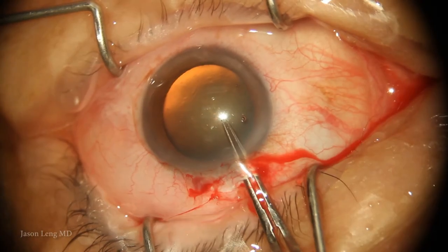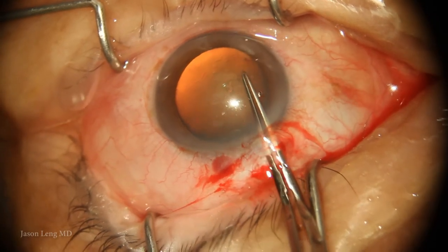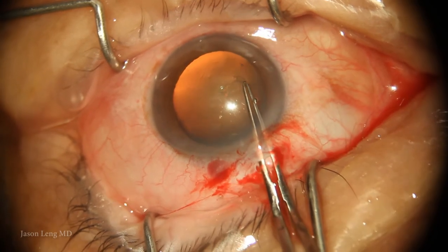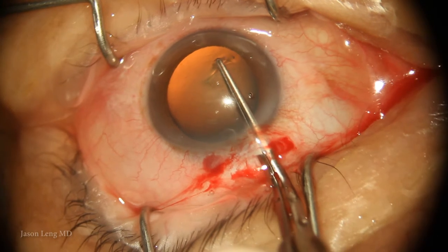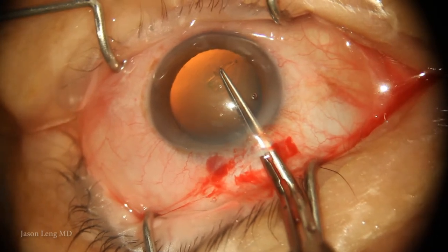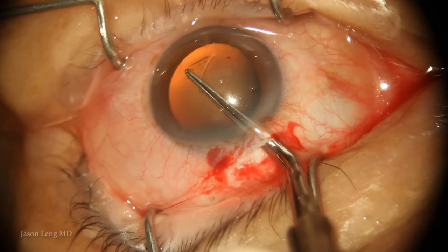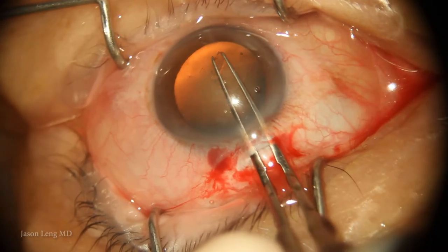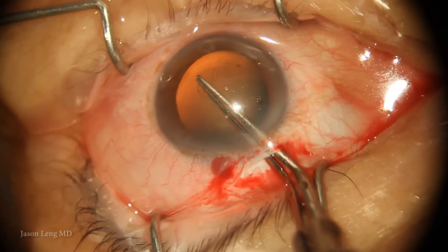I'm proceeding pretty cautiously and picking up that flap with the Utrata forceps again. I notice a few things: the capsule is wrinkling around where I'm trying to go, and I'm having a difficult time making progress. Especially when trying to round the corner, I realize the edge is not really moving — I'm just torquing the whole lens and the whole bag.